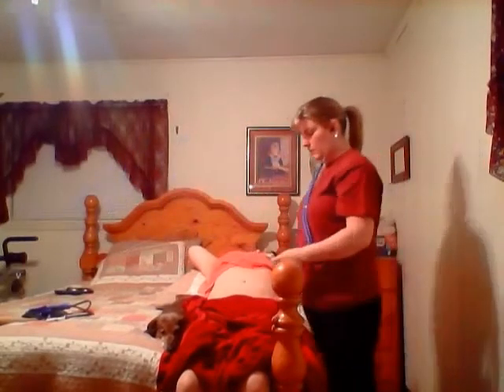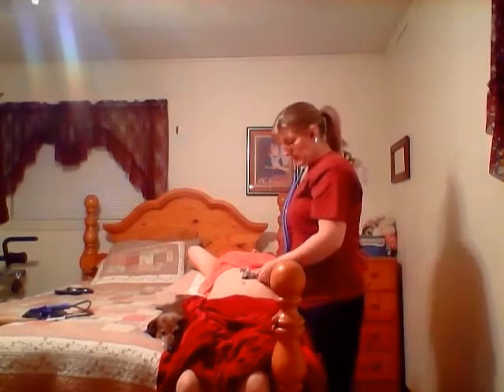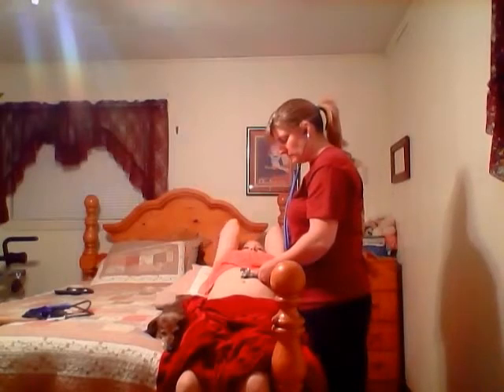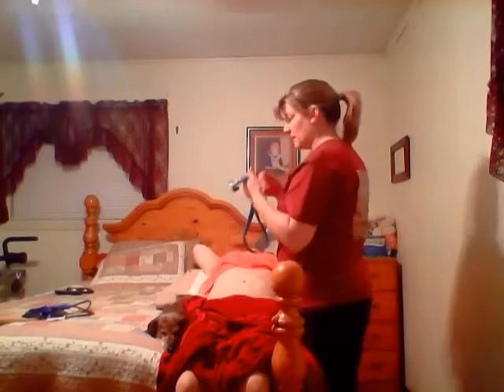You can also listen, we listen for the bruit in the carotid. You can listen for a bruit in the abdominal aorta. Sounds normal, no bruit noted.